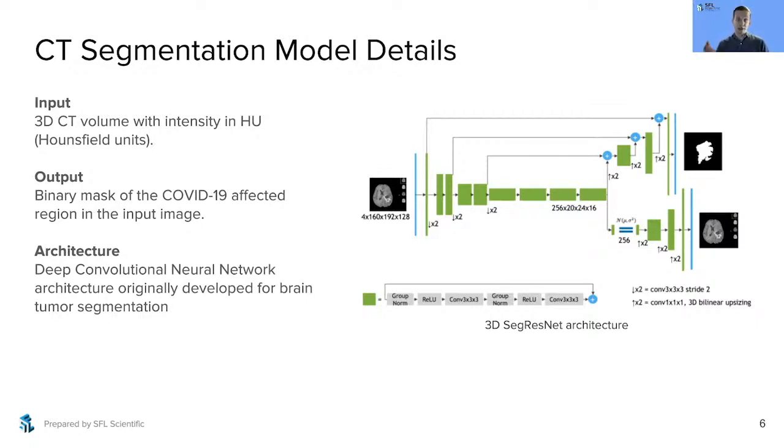It should be noted that this particular architecture also makes use of more advanced features such as autoencoder regularization and skip connections to achieve its results. More broadly, coming up with a model architecture is a time-consuming and empirical process. Academic institutions, research groups, and large organizations make a lot of pre-trained models available for free or as an enticement to use their platform, as is the case with Nvidia Clara. So entities looking to train a model for commercial or public use have to compare the cost and benefit of developing, training, and testing a new model architecture from scratch with using a pre-existing pre-trained model and fine-tuning, which is generally faster, cheaper, and requires less data.